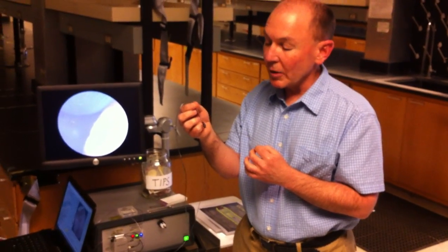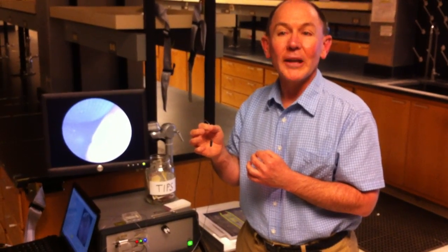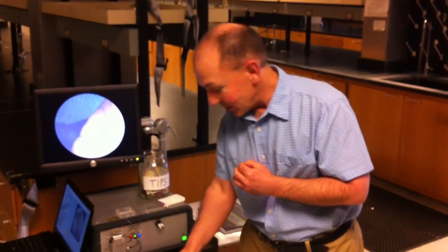And we've run about 11 patients through this at the Veterans Hospital here in Seattle. And most of these patients have to undergo the normal procedure afterwards, where they have to put them out, swallow the big scope, requires anesthesia. And all of them have said they highly prefer just swallowing this device.